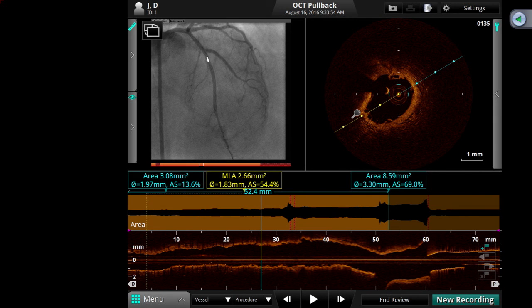No, let me tell you, let's go back. If with the DES you see this, you will leave it alone also. Yeah. Okay. Means you have seen the rest of the area, well opposed. Yeah. Okay. So let's complete our presentation.